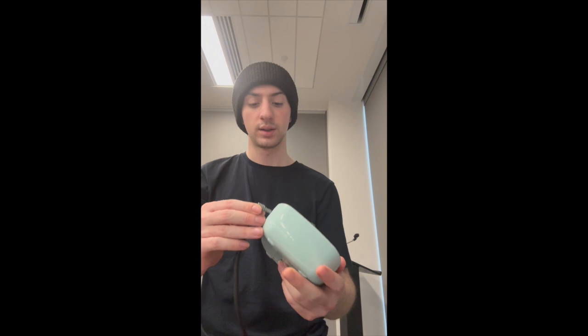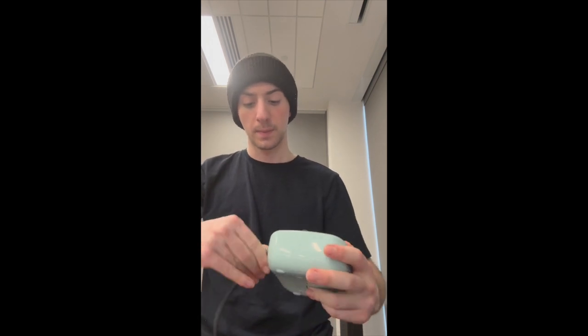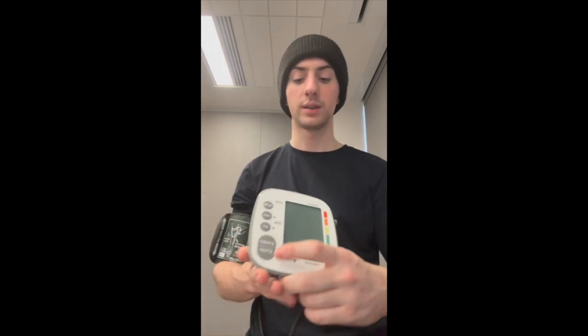Then this wire, you're going to connect right here, and then just press start. So it should inflate. You should put your hand down and relax your hand. If it's tense, it's going to give you a different reading.